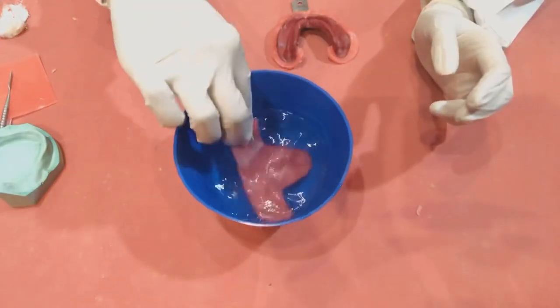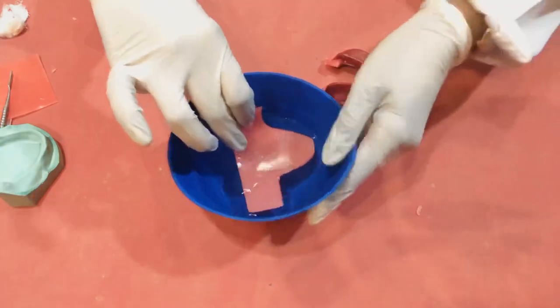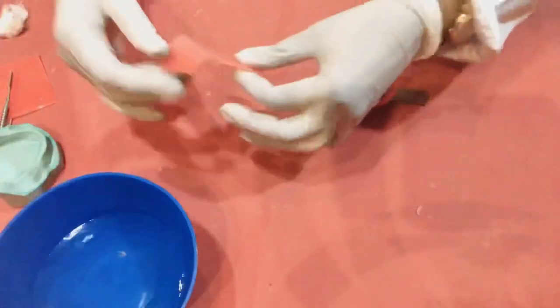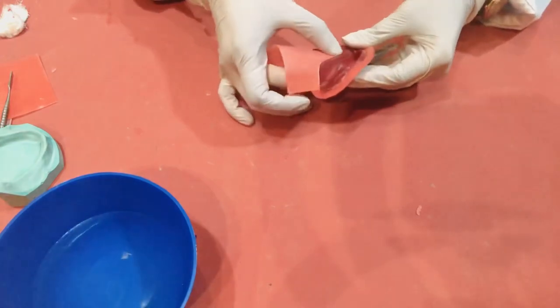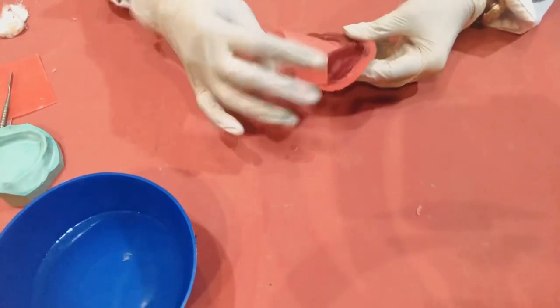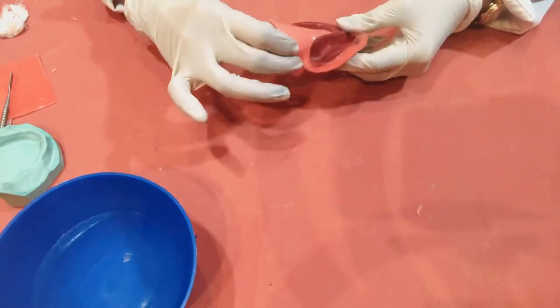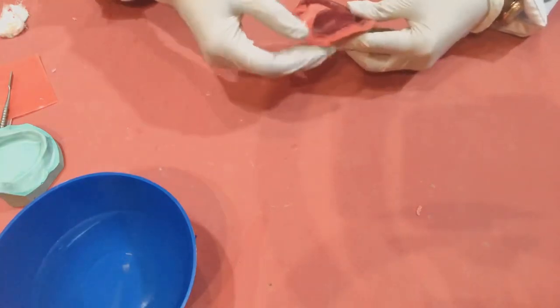I find it easier to contour and adapt when I soften this wax sheet in warm water. Adapt it to the lingual borders of the impression. Again the same rule, keep it two to three millimeters below the borders of the impression.